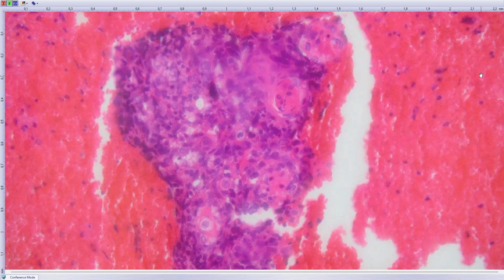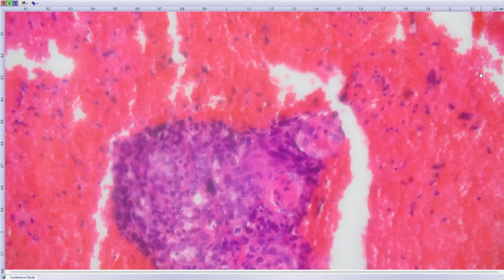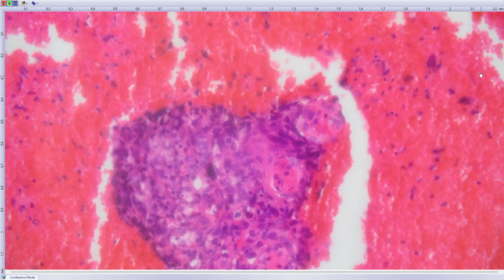I believe this is pretty much an easy case, okay? So any guess or a diagnosis? It looks epithelial and it looks squamous, okay? So the next step we have to do, because it looks like keratinizing atypical looking squamous epithelium, we should do P16 staining.